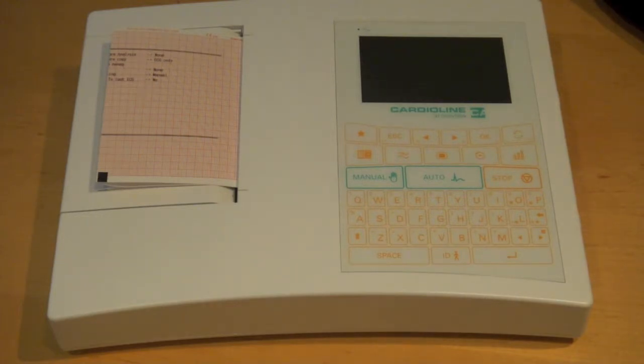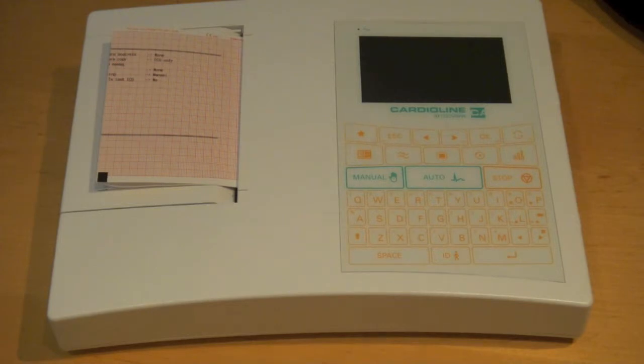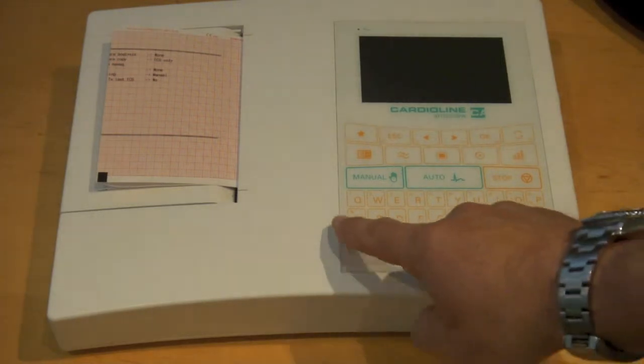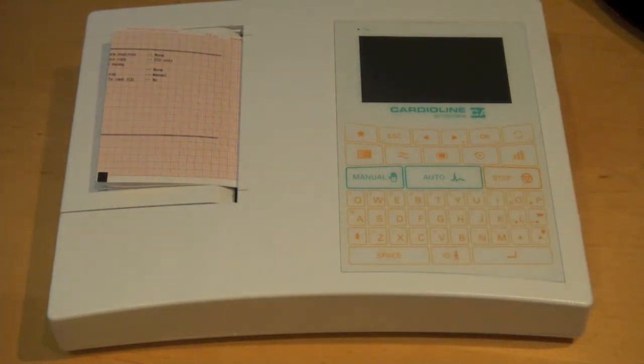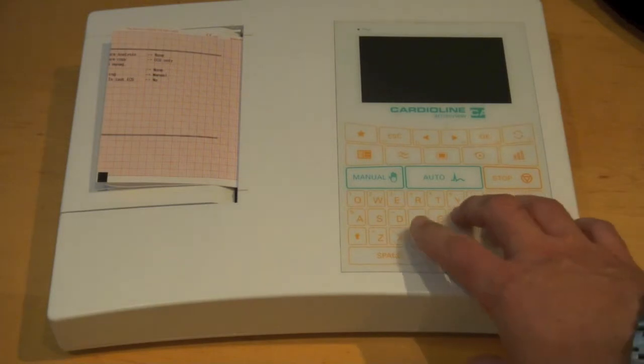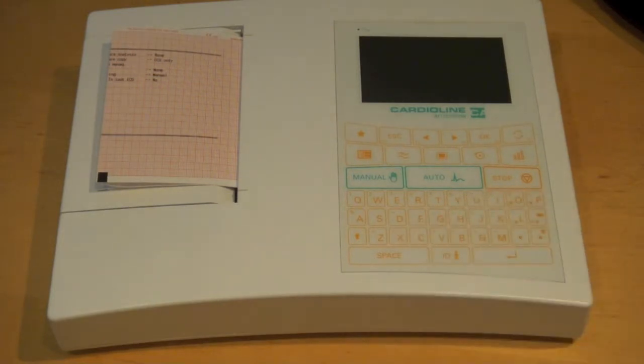The nice thing about the AR-1200 over the little brother, the AR-600, is that this particular unit does include a full QWERTY keyboard, which is useful for entering patient data.